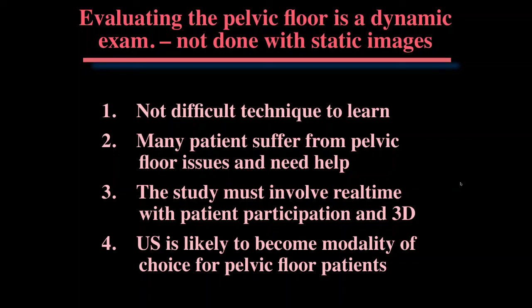But the patients are referred because they are symptomatic. This is not something that you're going to do for screening. Because if the patient's not symptomatic, then unless there's a mass there, you don't need to screen. So no, this should not be part of the regular exam.